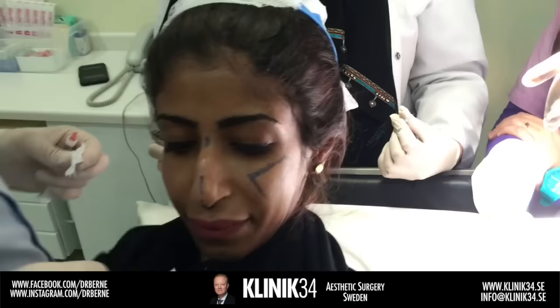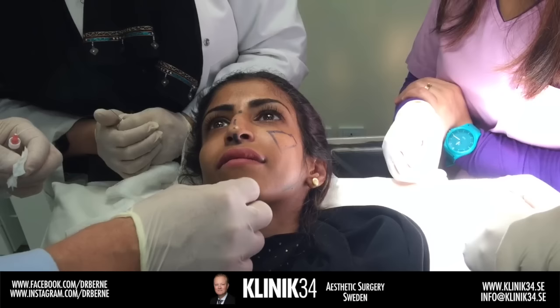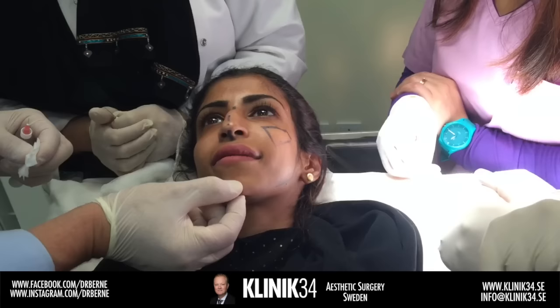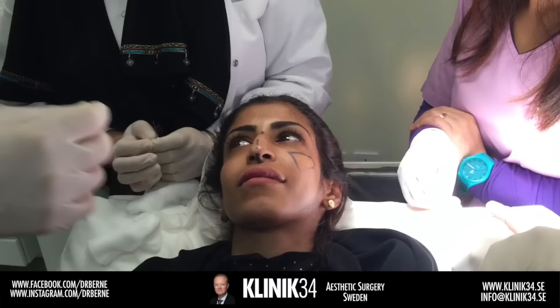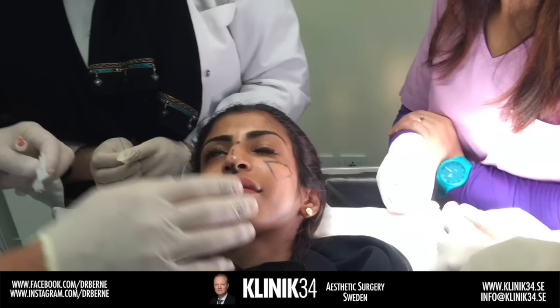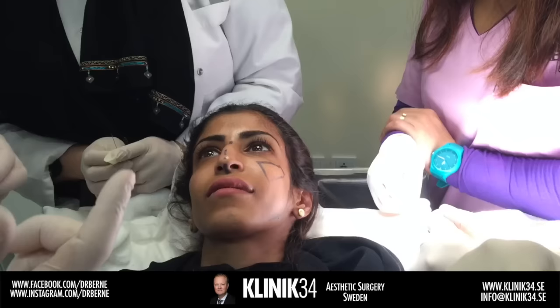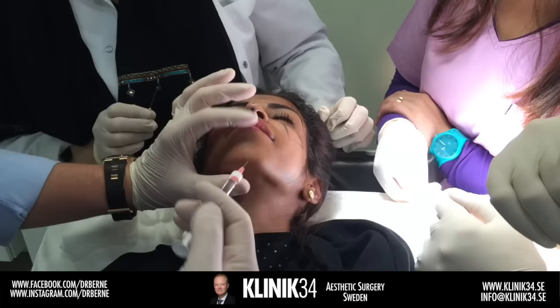For the chin we have basically two techniques: one is perpendicular and the other is a lateral approach. With the perpendicular approach we can't really control the level — injection ends up in the submuscular space and into the muscle, but also subcutaneously. This chin is really, really tight, so there's a limit to how much volume I can add by perpendicular technique. If I want more projection without visible filler I need a lateral approach, going subperiosteally — in the subperiosteal space the gel is contained and won't be visible, but the result will be visible.